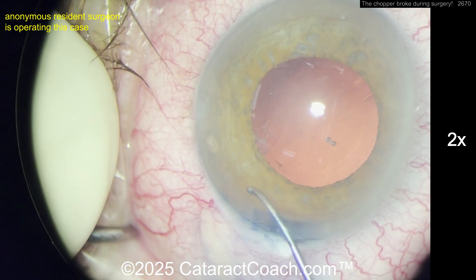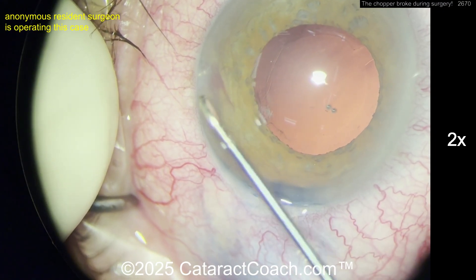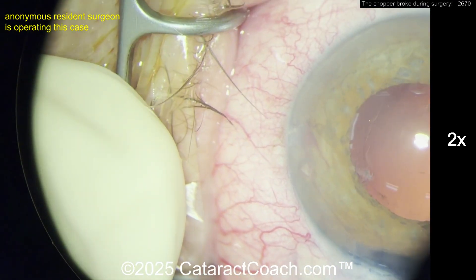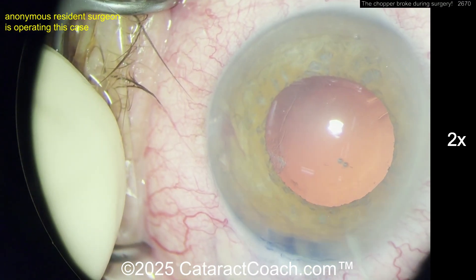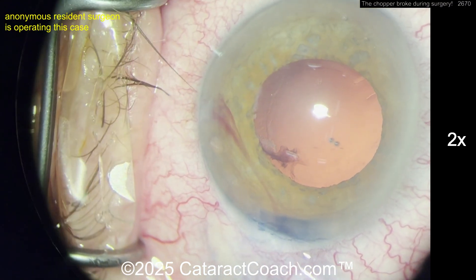We're going to go in through the main incision with another hook or something to bring it out of the angle. I like that idea too, but again I'd put a big wave of viscoelastic to push it out of the angle — use a cohesive viscoelastic, that'll really displace it a lot better. And there you go — capsulorrhexis forceps, grab it gently. Nicely done.